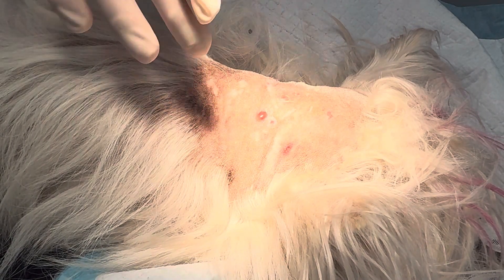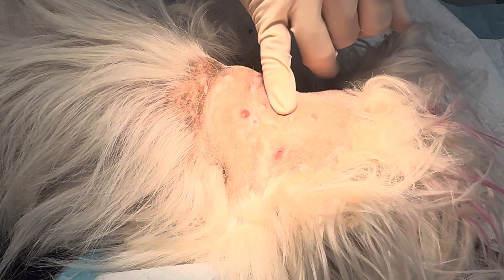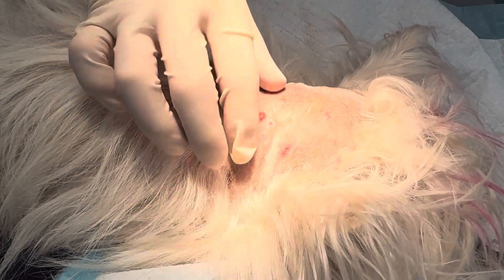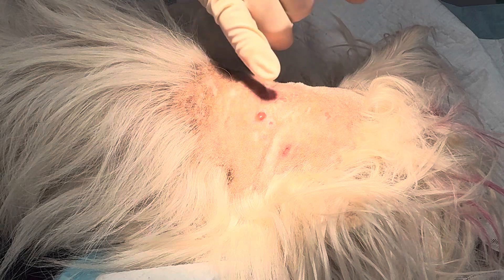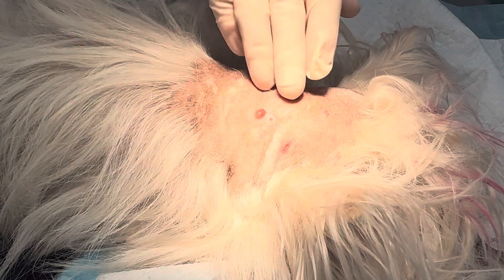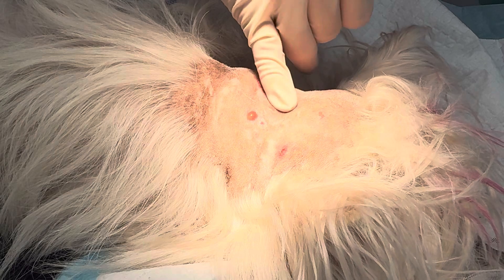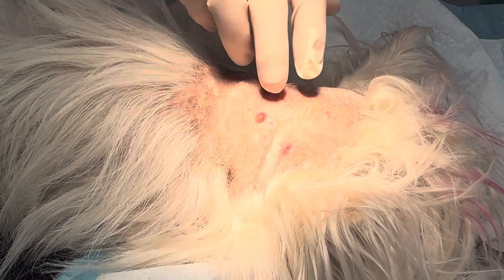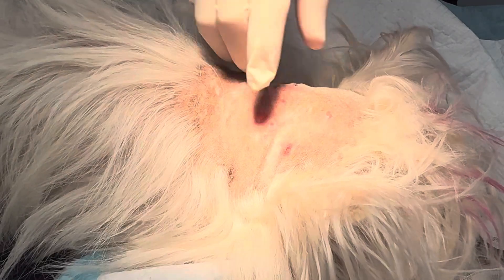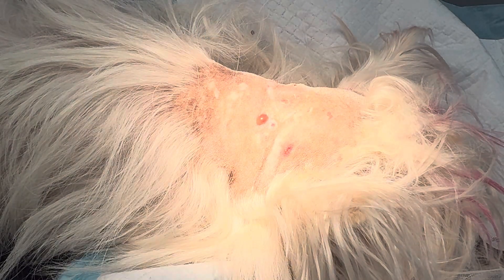Hi guys, Dr. Daniel again. This is a little girl that's been bitten on the back of the neck. I saw her yesterday evening and unfortunately didn't have time to do surgery, so she's come in this morning. She was bitten on the back of the neck, there are a few puncture wounds and I can feel a pocket underneath. I did start antibiotics for the broad spectrum yesterday at 12.5 mg per kg along with an anti-inflammatory, and it's definitely improved a lot but there's still a big pocket underneath.